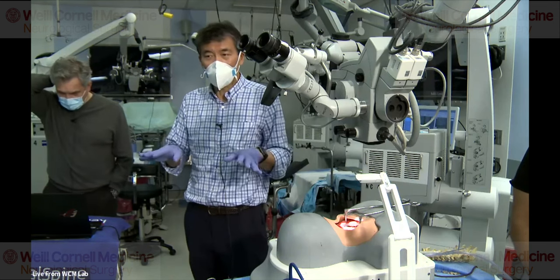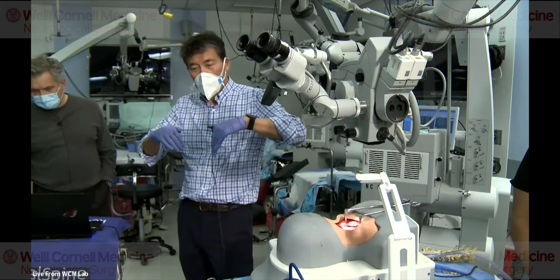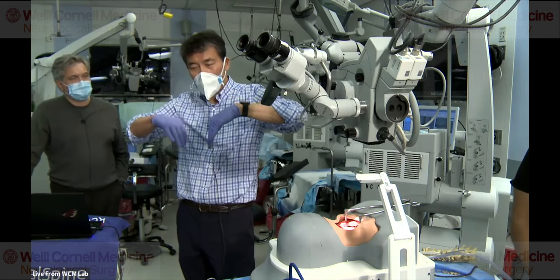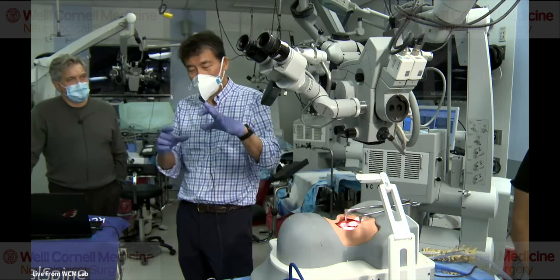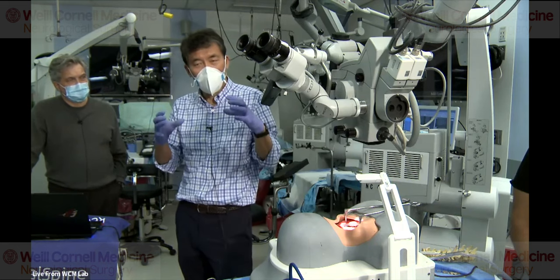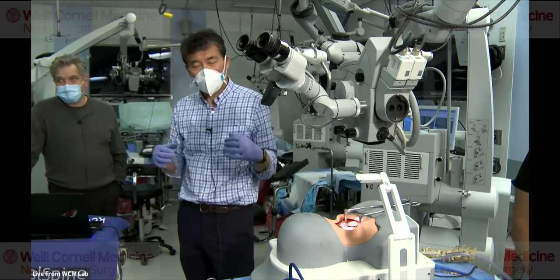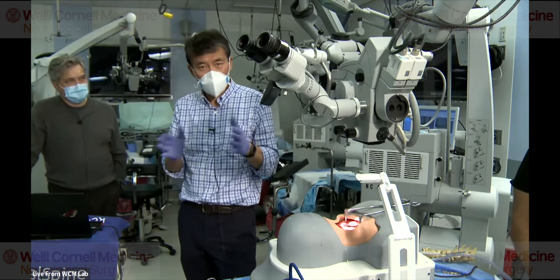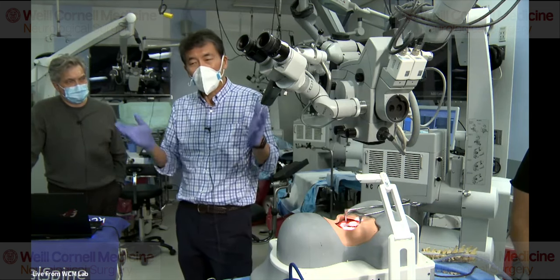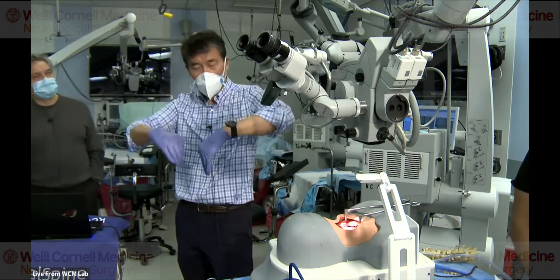Be very gentle with the retractors. I don't use retractors with teeth like that. I use McCulloch retractors, which were invented by John McCulloch, and they're flat with a little thing at the bottom. I put a 2x6 patty, which I call a mongo patty, as in humongous patty. I put that in, and then I put the blade on top of it. By doing that, and by irrigating frequently, the soft tissues don't dry out. Anytime I use retractors, I put that patty first, and then I put the retractors on.